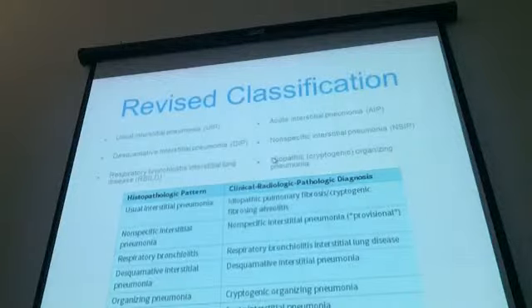These are pathologic terms up here. This is what we might sign on a report. But it's important to understand that a radiologist has also looked at these, and they have clinical features that also correlate. So usual interstitial pneumonia is intended to imply a particular progress and a particular outcome.